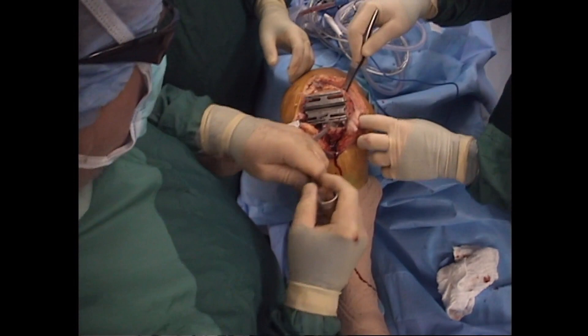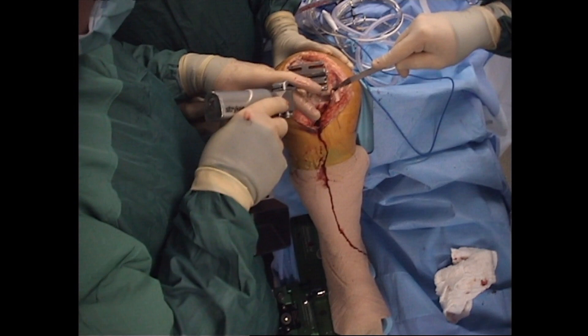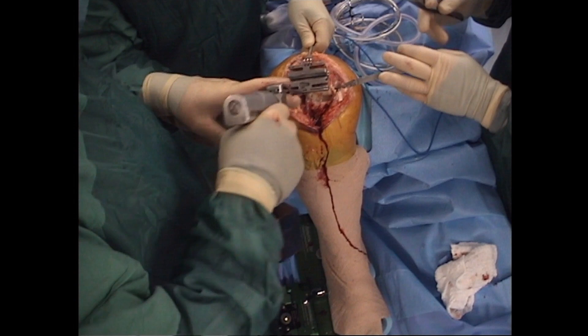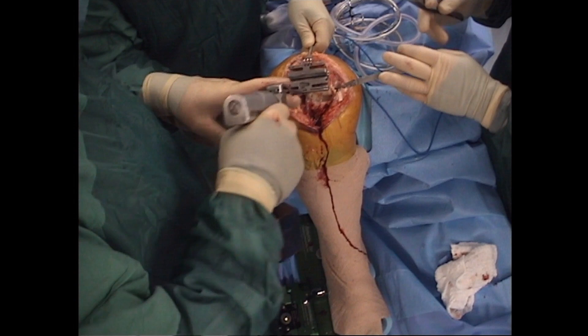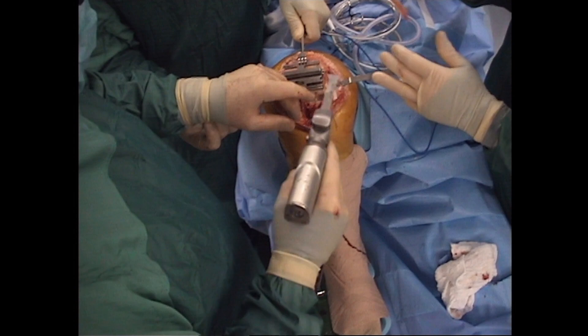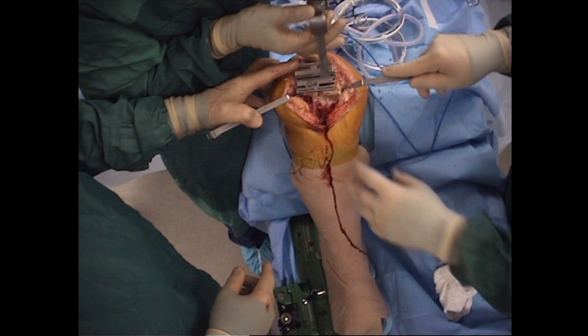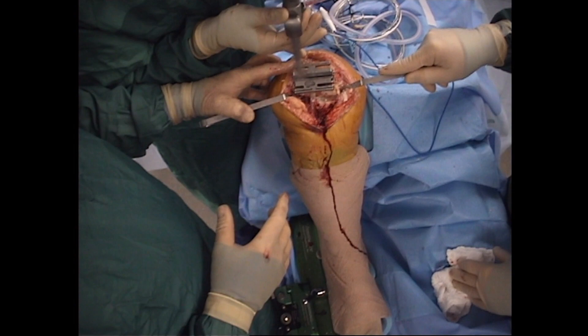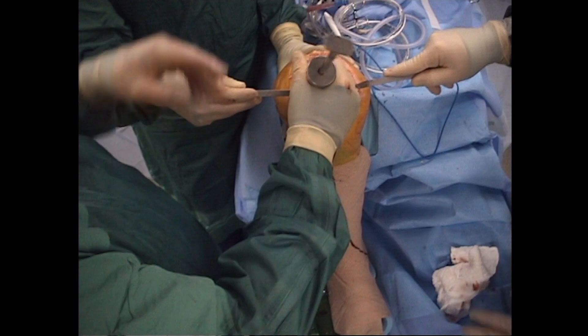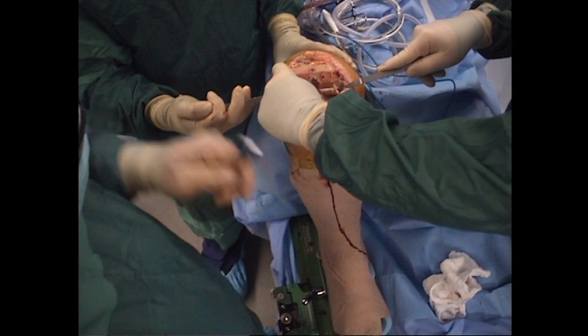Hohmann retractors are then placed, and the posterior condyles are cut. A rake retractor is used to secure the cutting jig while the anterior chamfer cut is made. The posterior chamfer cuts are then made in similar fashion, and are polished with the saw once again to allow for maximal fit of the cementless system, as the chamfers are typically the area where the prosthesis gets held up with any imperfections. The incomplete posterior condylar cuts are then finished with a straight osteotome. This method allows for resection of the majority of the posterior osteophytes.